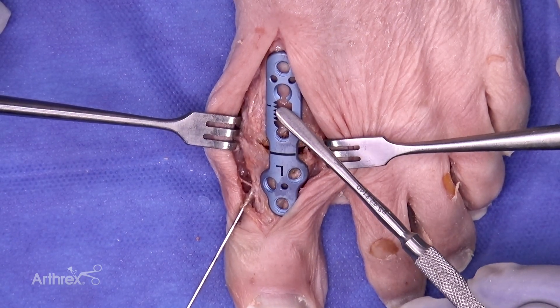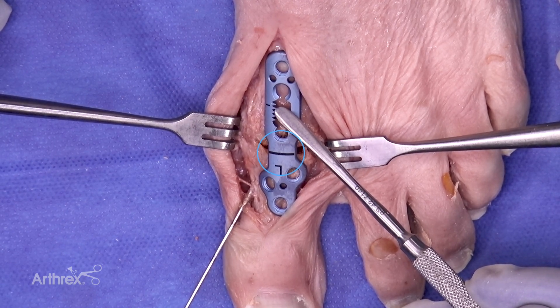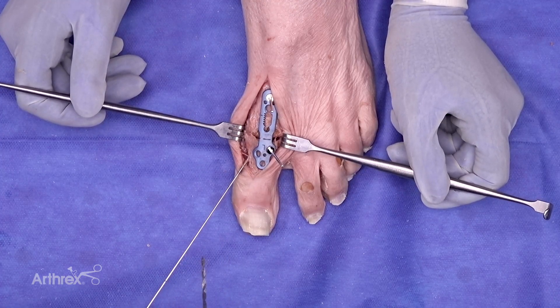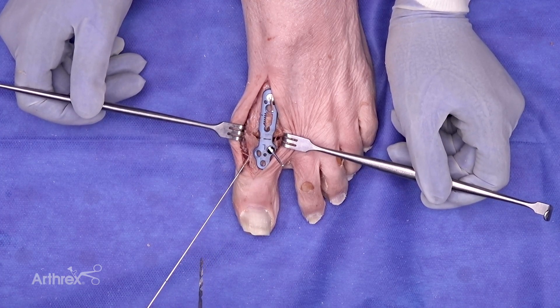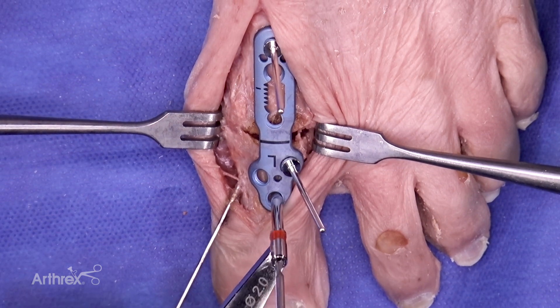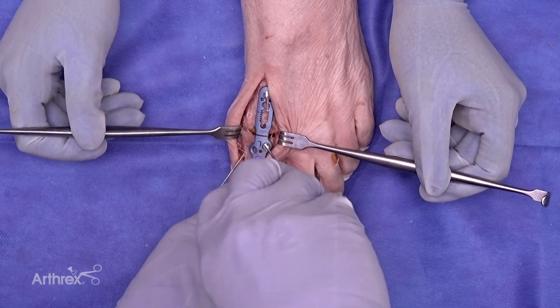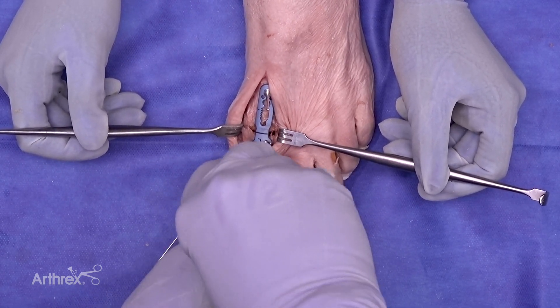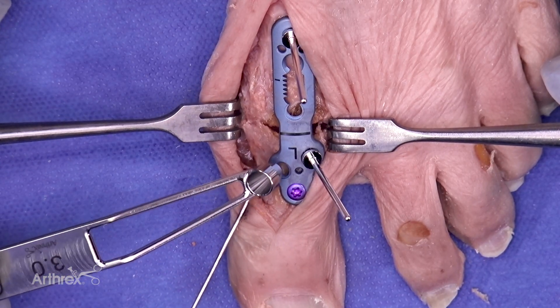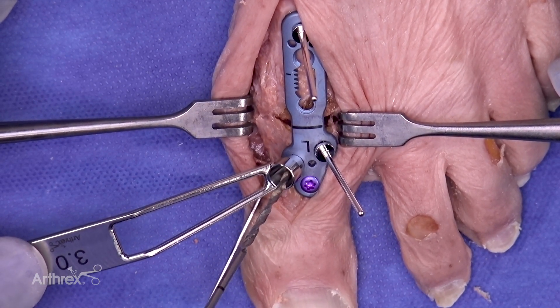After sizing, we've selected a standard straight plate. Utilize the laser line to locate the joint for proper position of the MTP fusion plate. What's nice about the MaxForce plating system is you don't have to change your original technique. I utilize the first screw distally as a cortical screw to compress the plate to the bone, using the 3.0 mm cortical screw for compression of the plate to the bony cortex. The remaining holes in the proximal phalanx will be filled with the VAL locking screws, which utilize a 30-degree cone for variable angles.